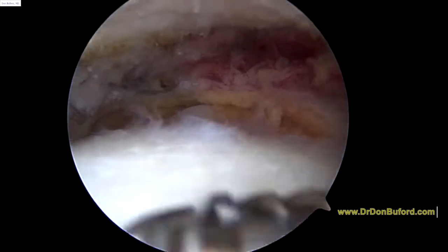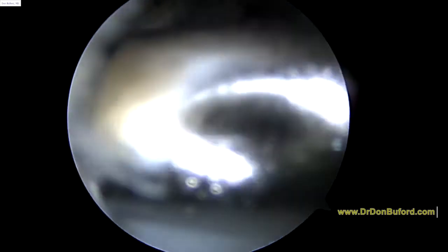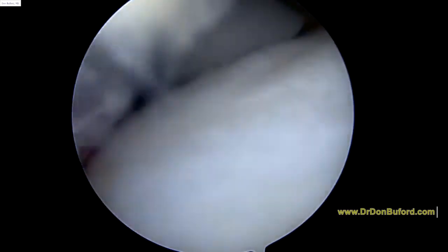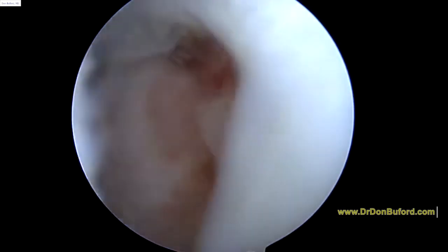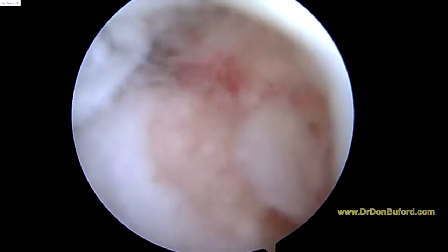And we're just going to try and find, remember that ultrasound showed us an area in the cuff that was torn. I haven't seen it yet, so I'm starting to wonder. Although usually the ultrasound's so sensitive, I'm pretty confident we'll see it. I've been guessing it's just far lateral. As we rotate and abduct your shoulder. Yeah, there, see there? So there's the hole right there. Okay, and so that is what the ultrasound showed us.